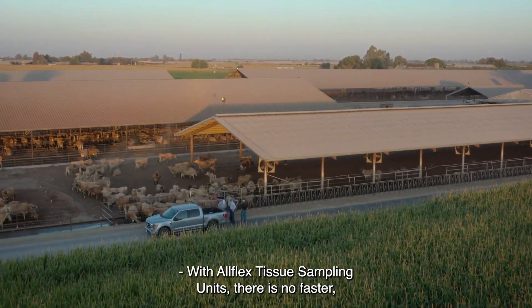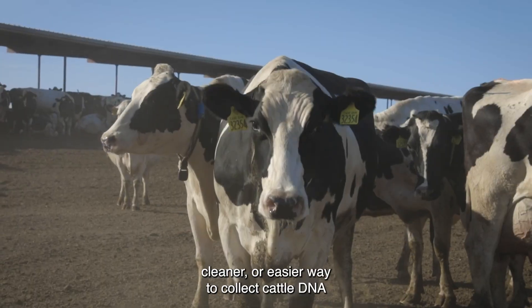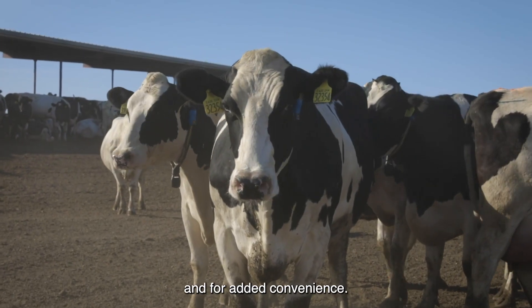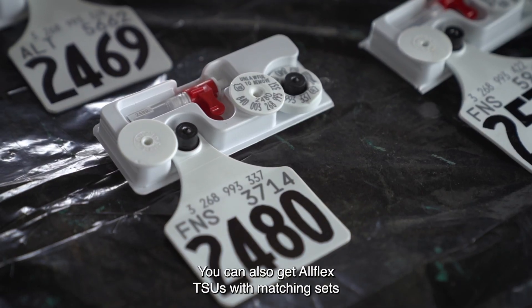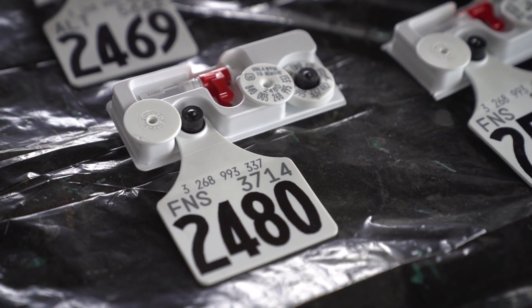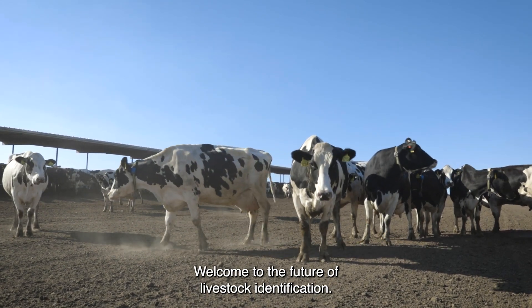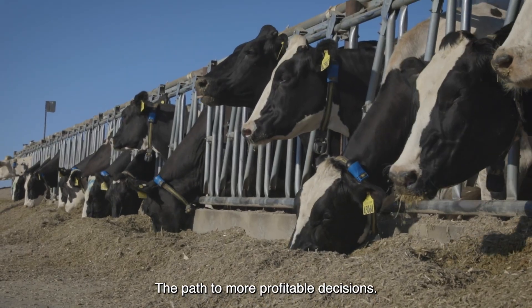With Allflex Tissue Sampling Units, there is no faster, cleaner, or easier way to collect cattle DNA. And for added convenience, you can also get Allflex TSUs with matching sets of electronic and visual ID tags. Welcome to the future of livestock identification — the path to more profitable decisions.